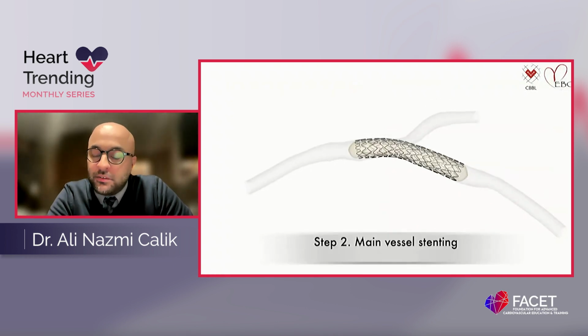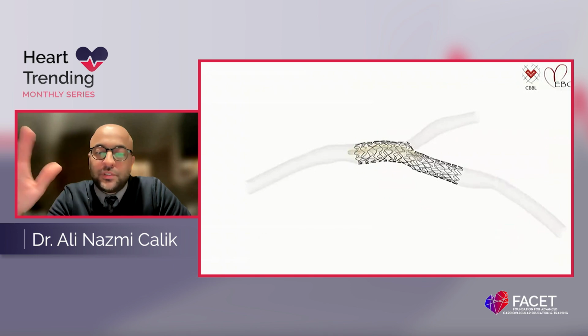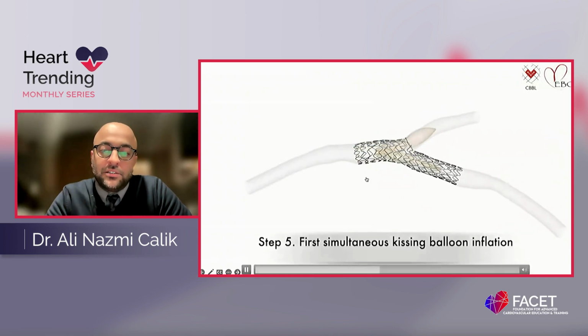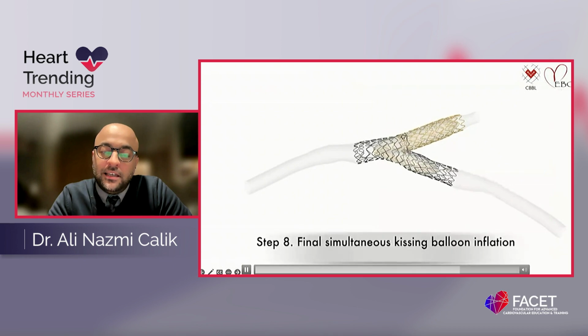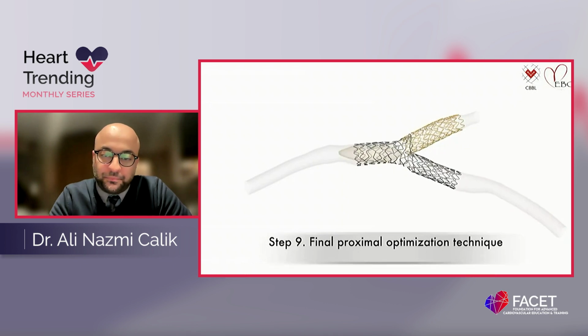This is a beautiful illustration of the TAP stenting, Chadi. As you can see, the first stent is deployed. 90% of the procedure is the same as the provisional stenting strategy. After POT, rewiring, and the first kissing, if you're happy, you can stop. But if you're not, you can continue with the second stent, as you can see in this illustration. T at the side branch, minimal protrusion to the main branch, and the final POT.